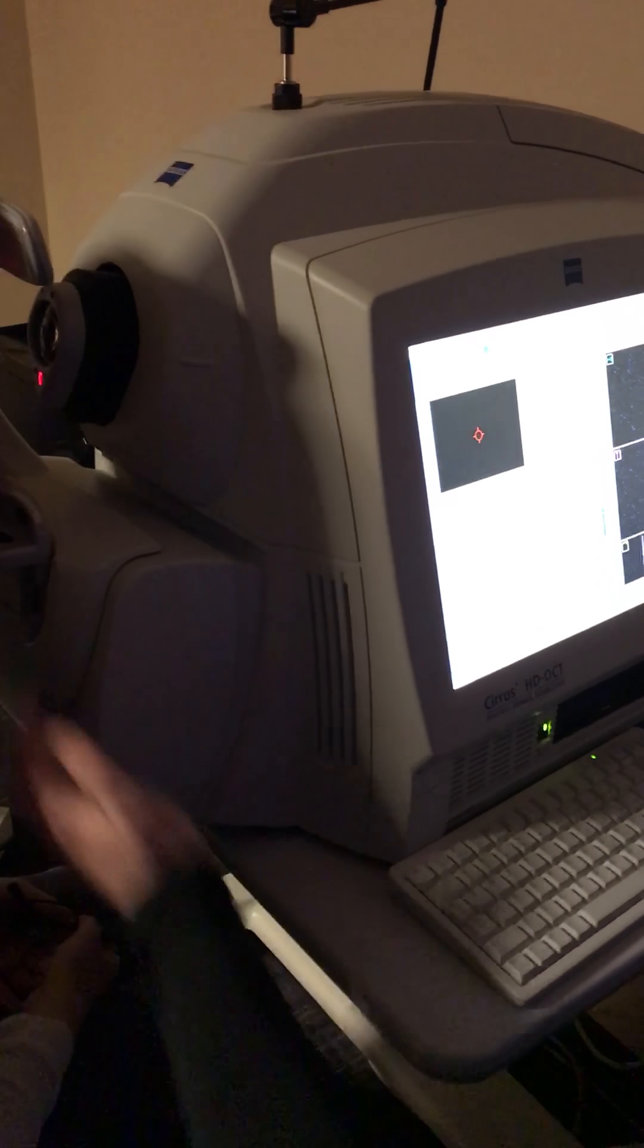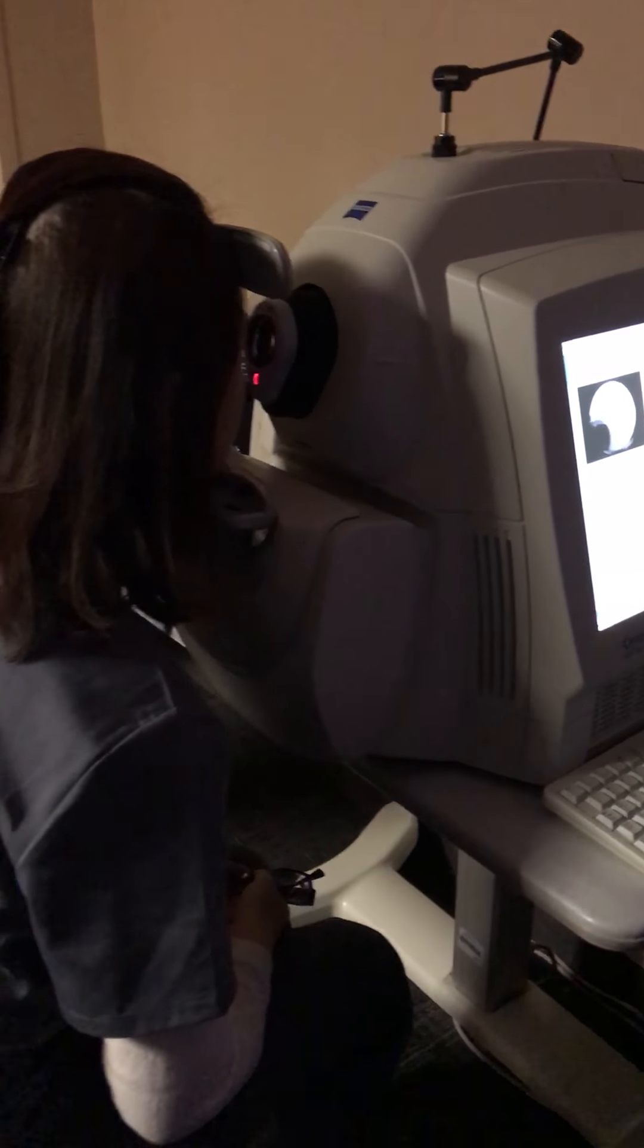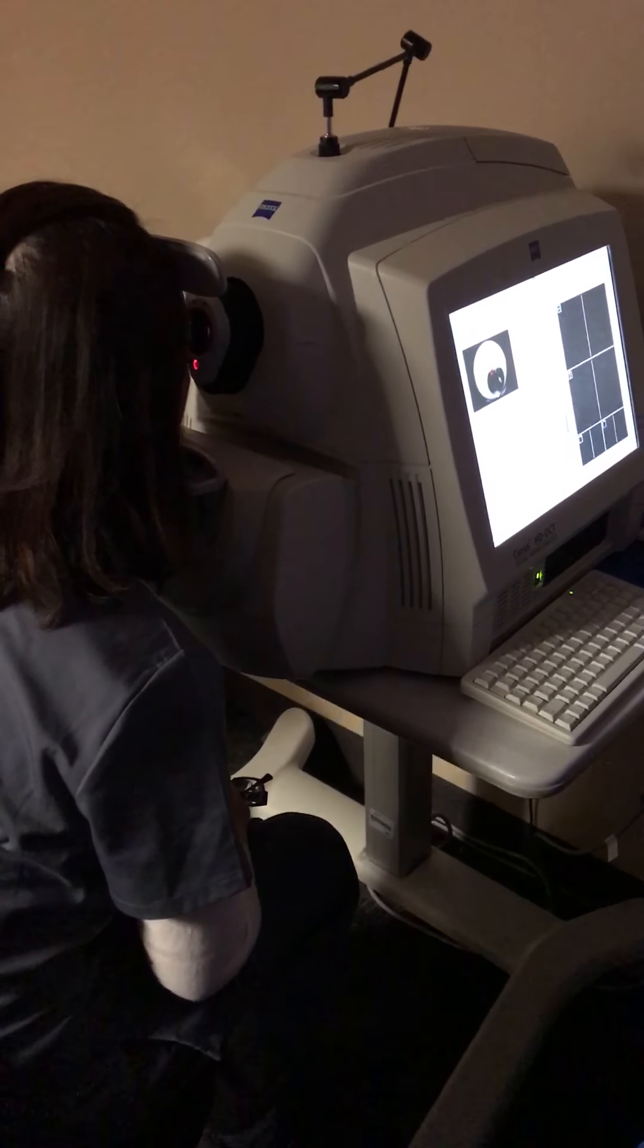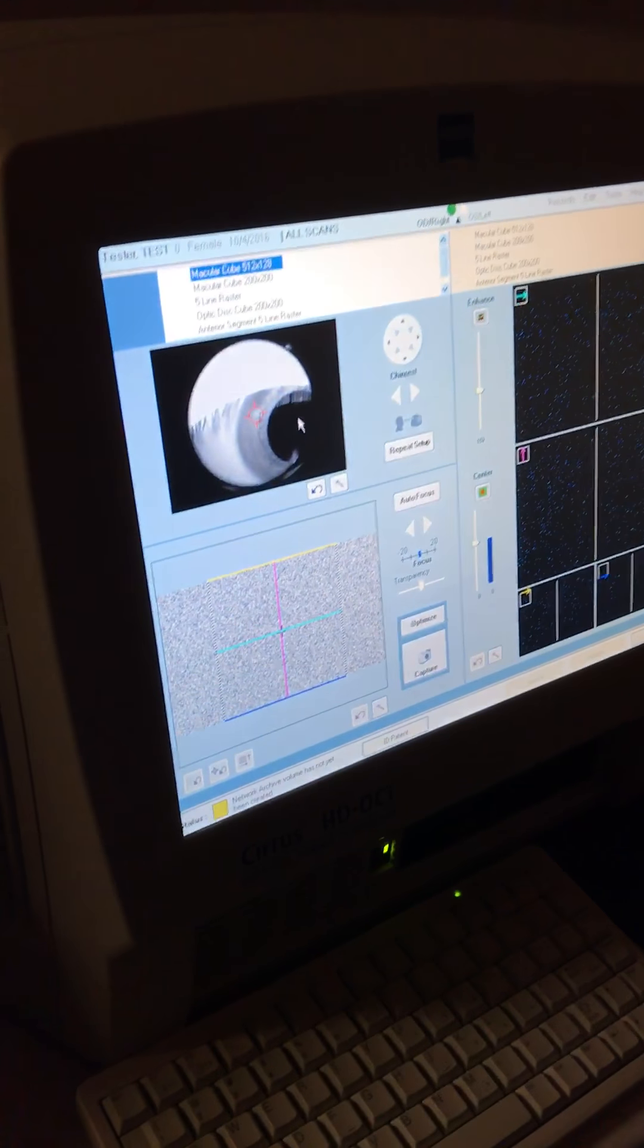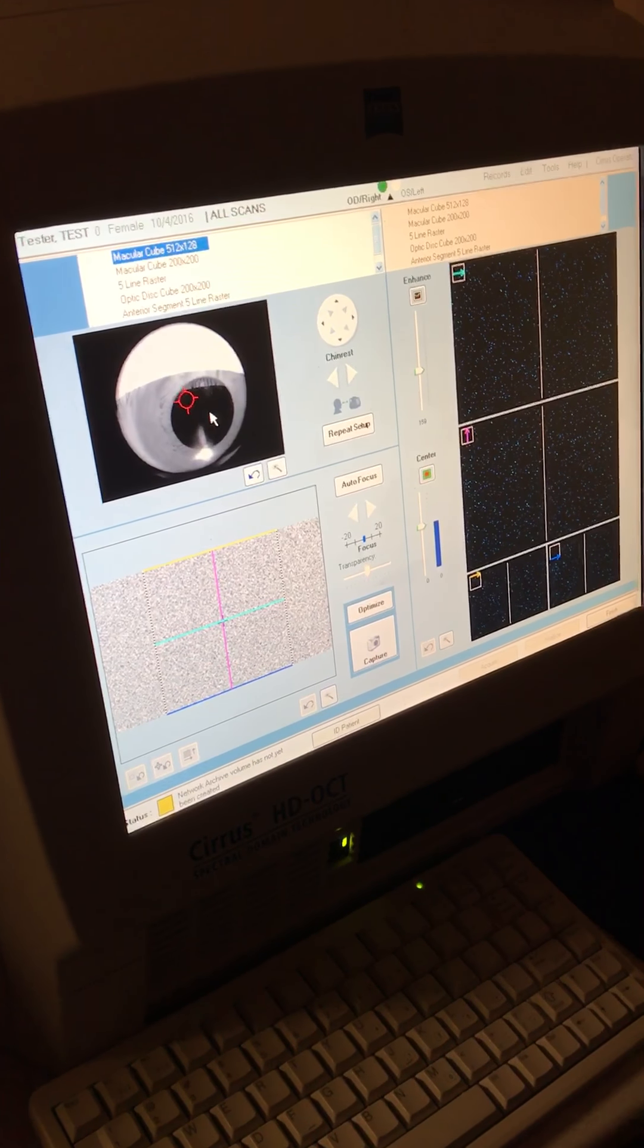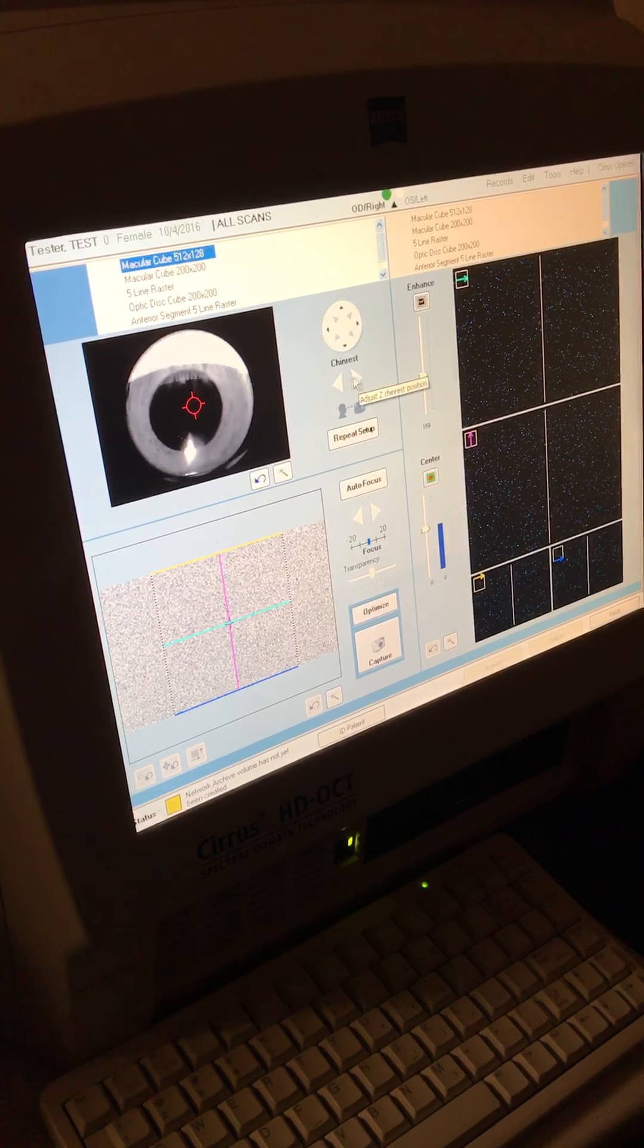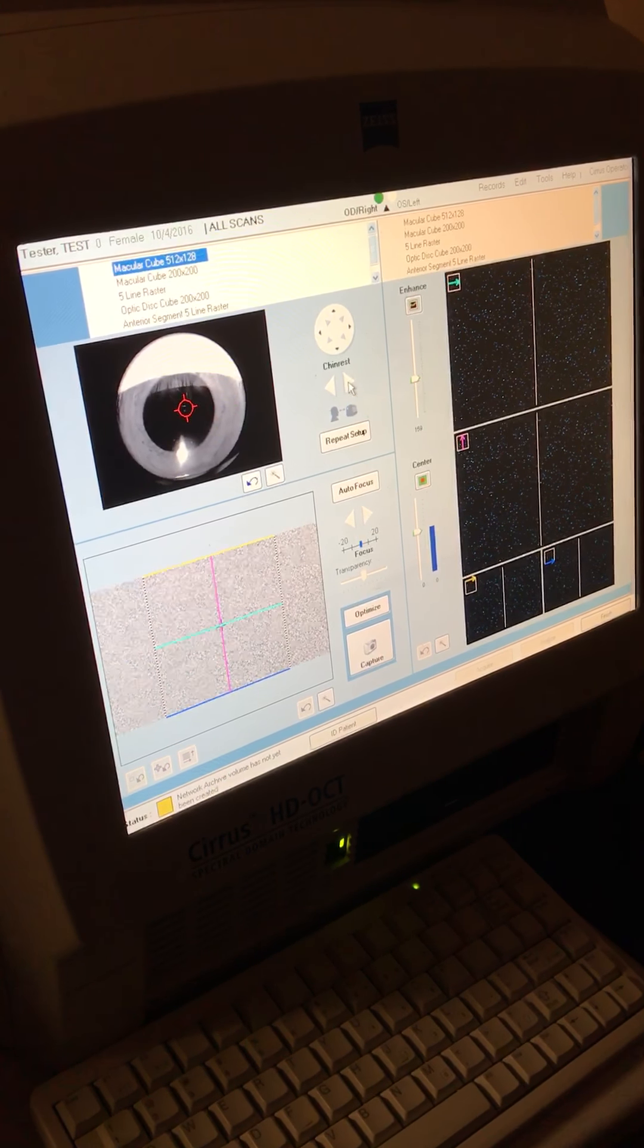So just come to the left chin rest first and then forehead goes all the way forward. And we're going to see an image of her eye on the screen here. So if you click on the pupil, it'll actually bring her where she needs to be. And then these buttons here will move the patient in and out. So I want to bring her in more.